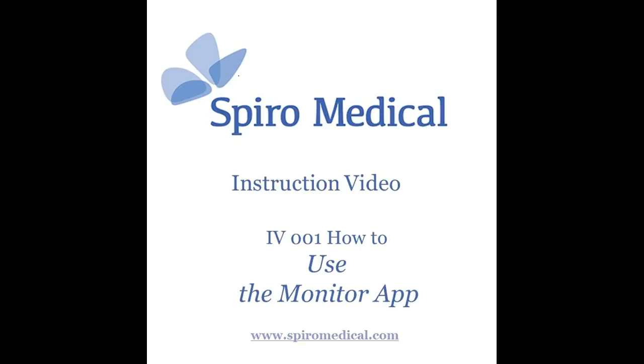My name is Rolf Karls Hansen from Spiro Medical and I want to show you how to use the ApneaGraph Spiro monitor application.